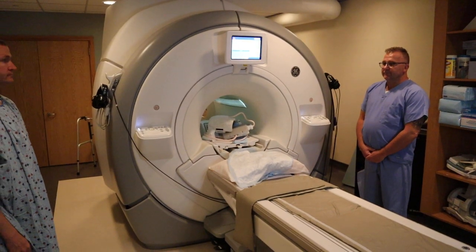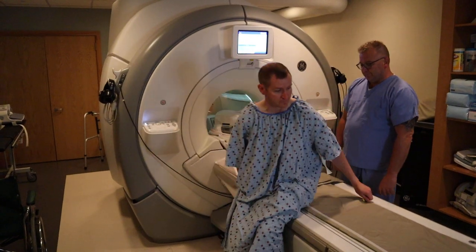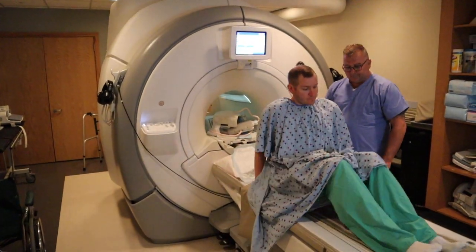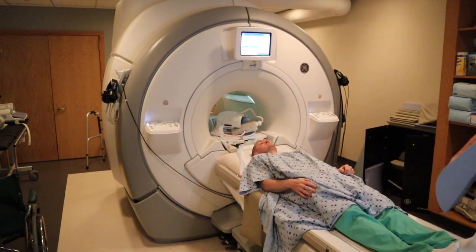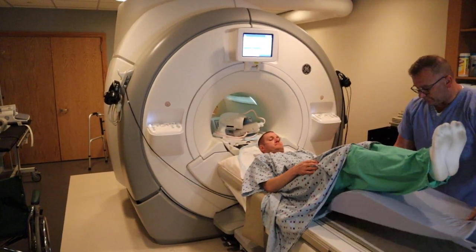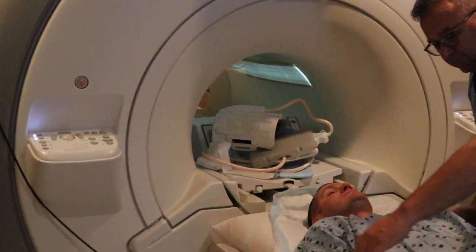We're now going to position for an MRI of the shoulder. There are two ways to position for a shoulder. You could use a dedicated shoulder coil, which is the more common approach. But for a patient with a larger body habitus, you can use the flex coil like how we did with the MRI of the elbow.